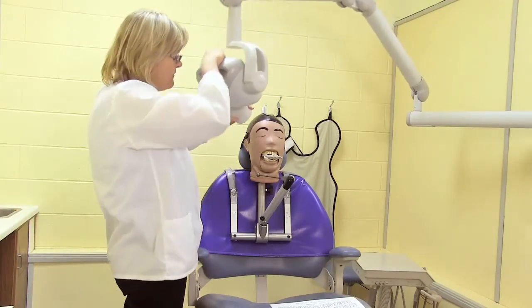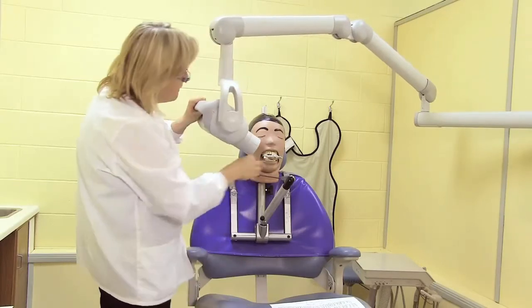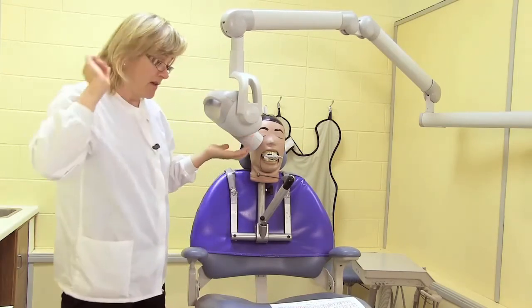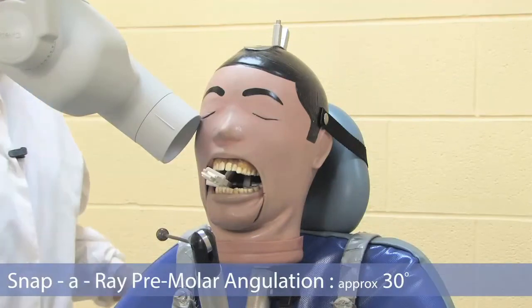So in this case, I've placed my film straight, no bending, in the shallow palate, slightly tilting the bite tab. And again, what will happen is I may have to increase the vertical angulation slightly. So in this case, I'm going to look at the premolar shot. And again, as I said, it's important to use that as your index in the beginning. It says about 30 degrees.